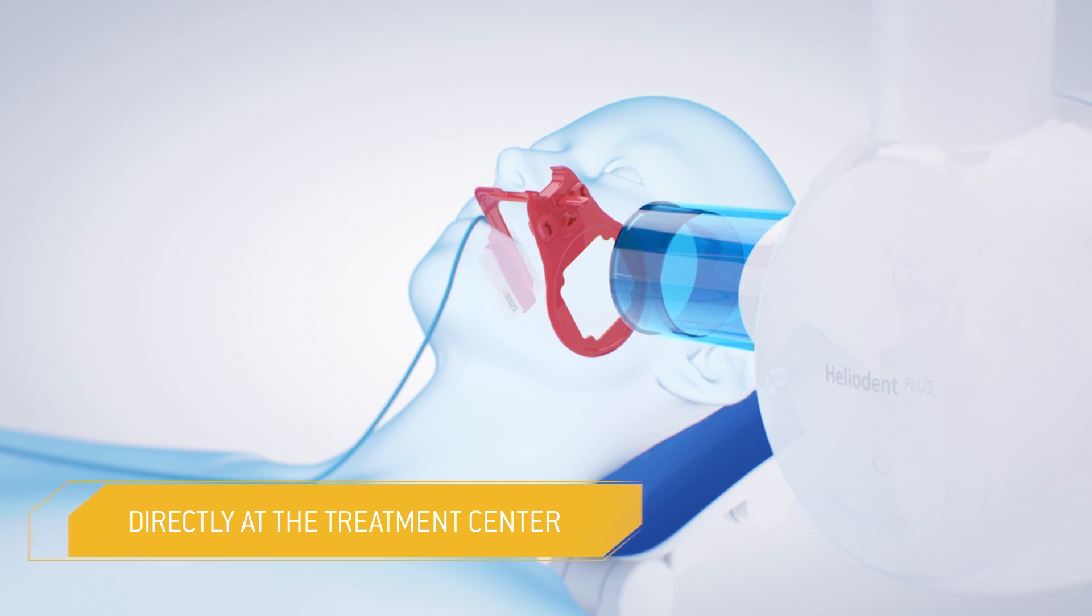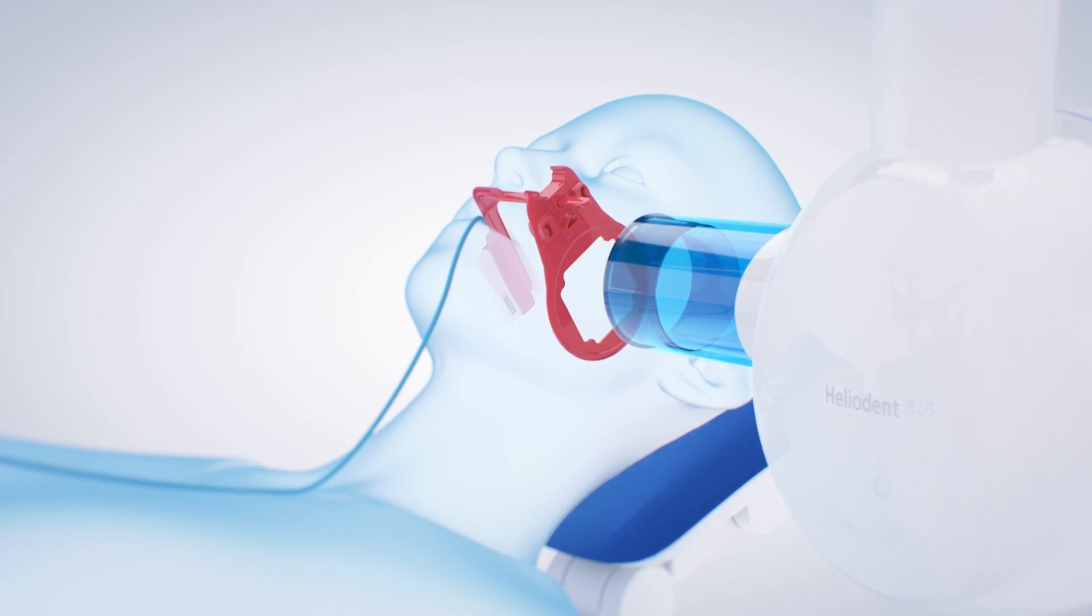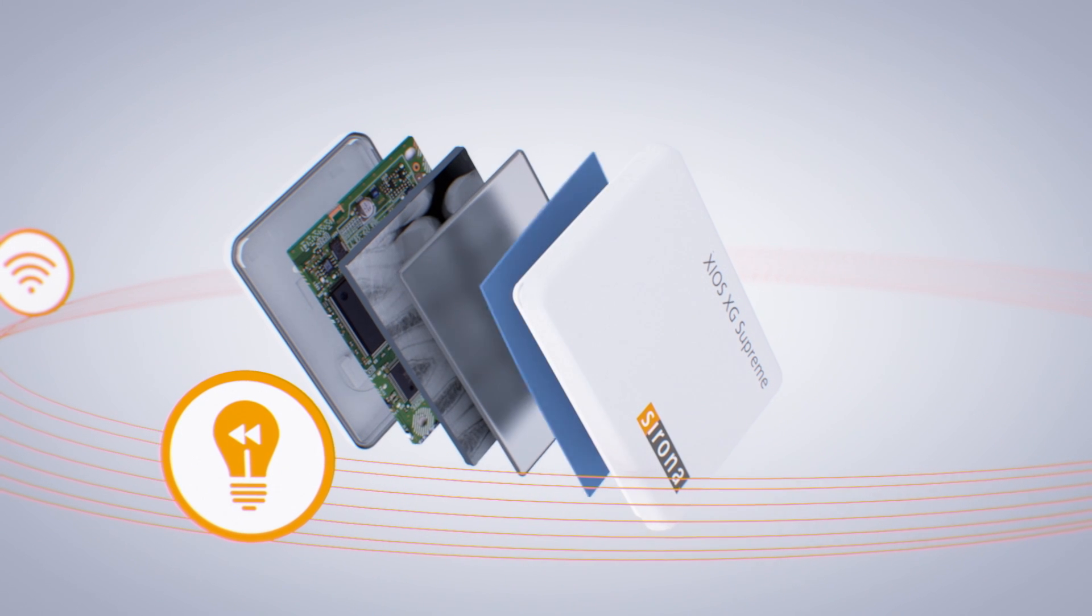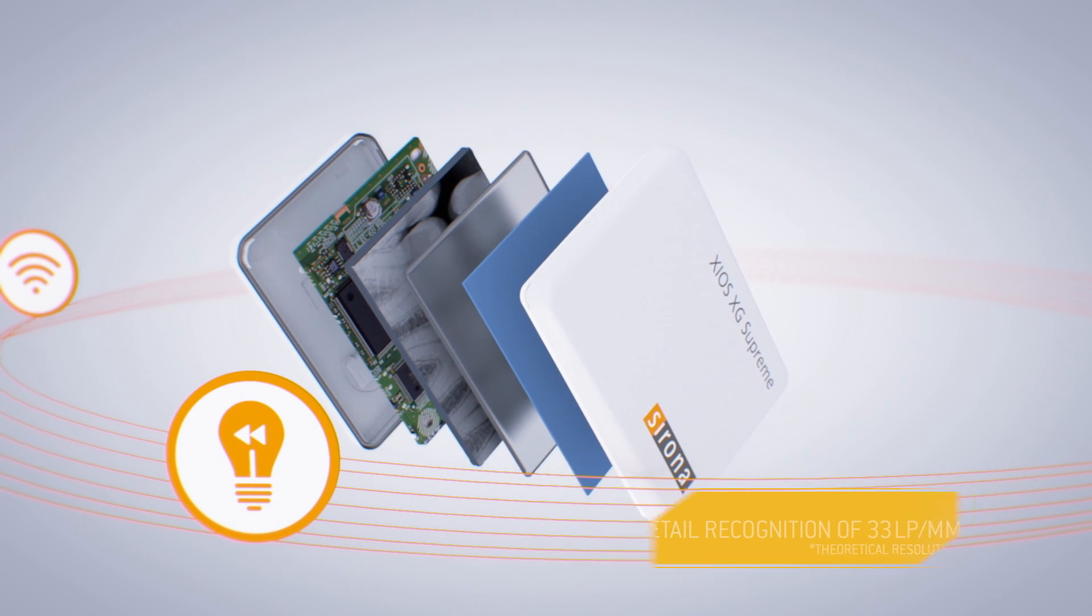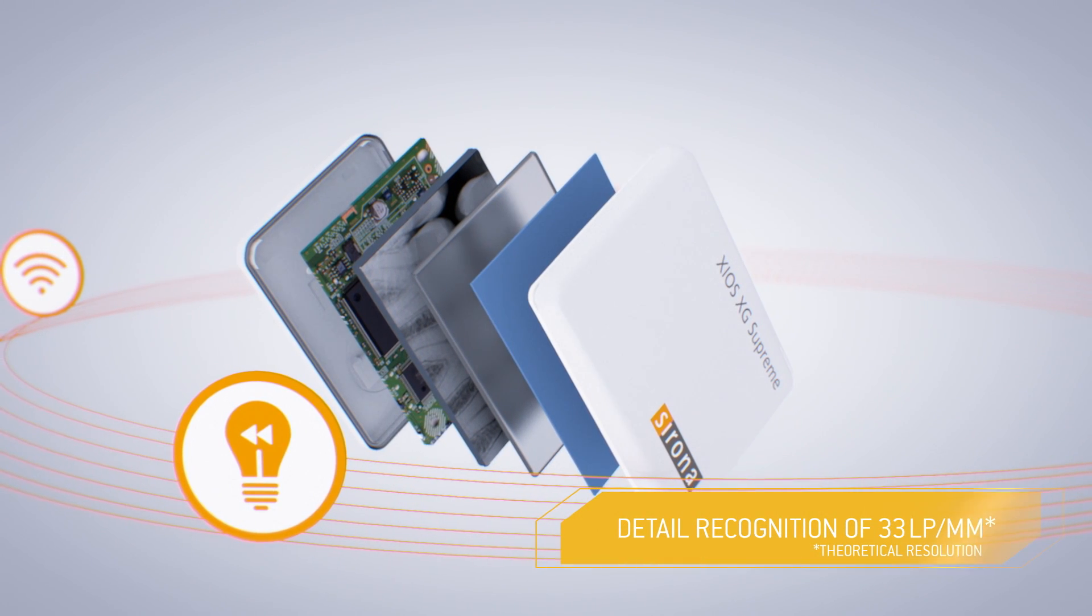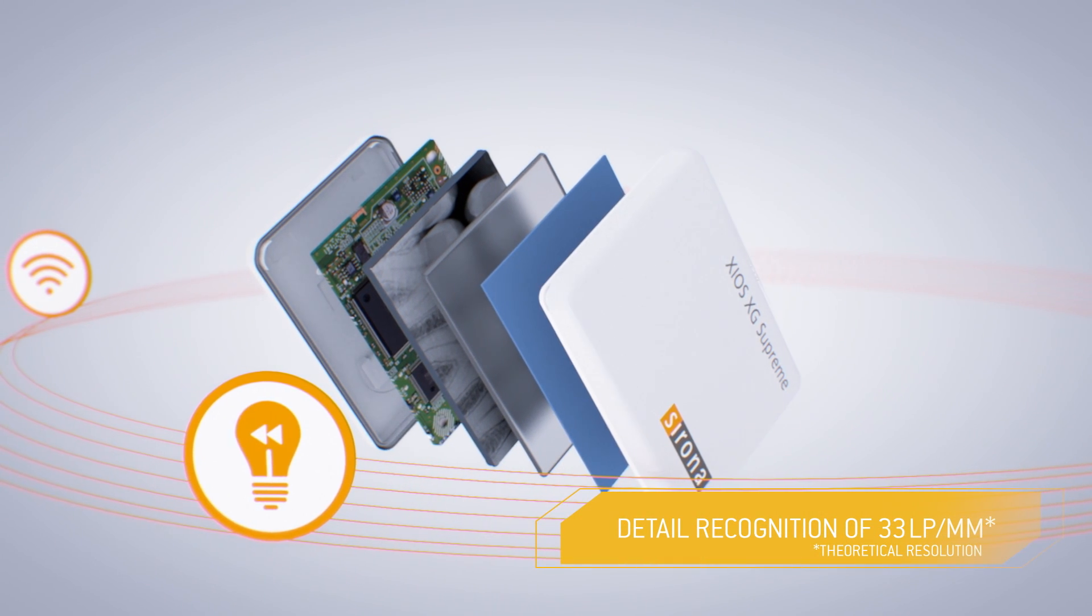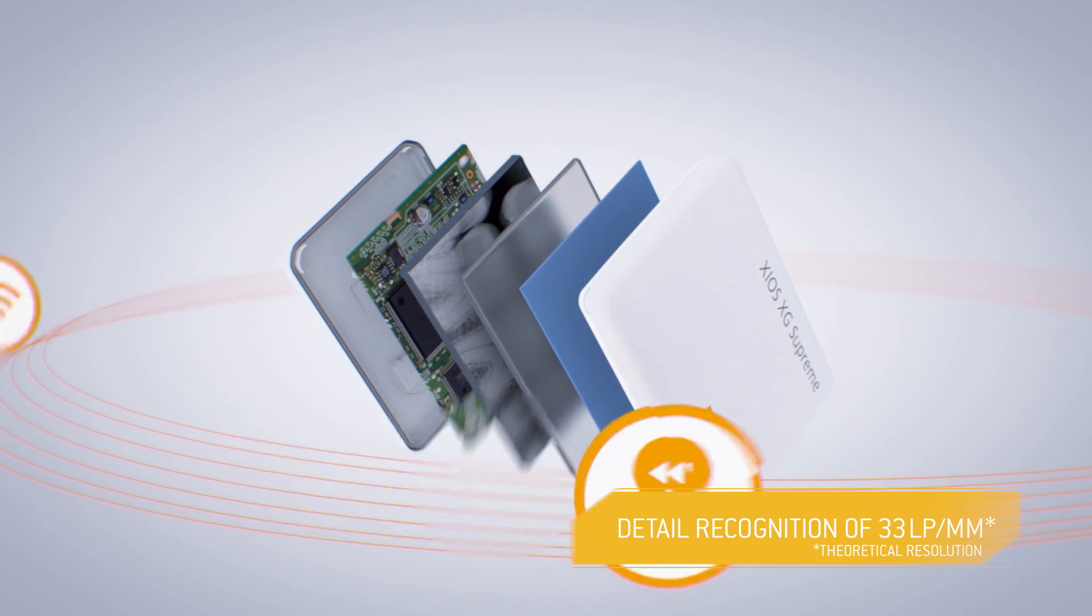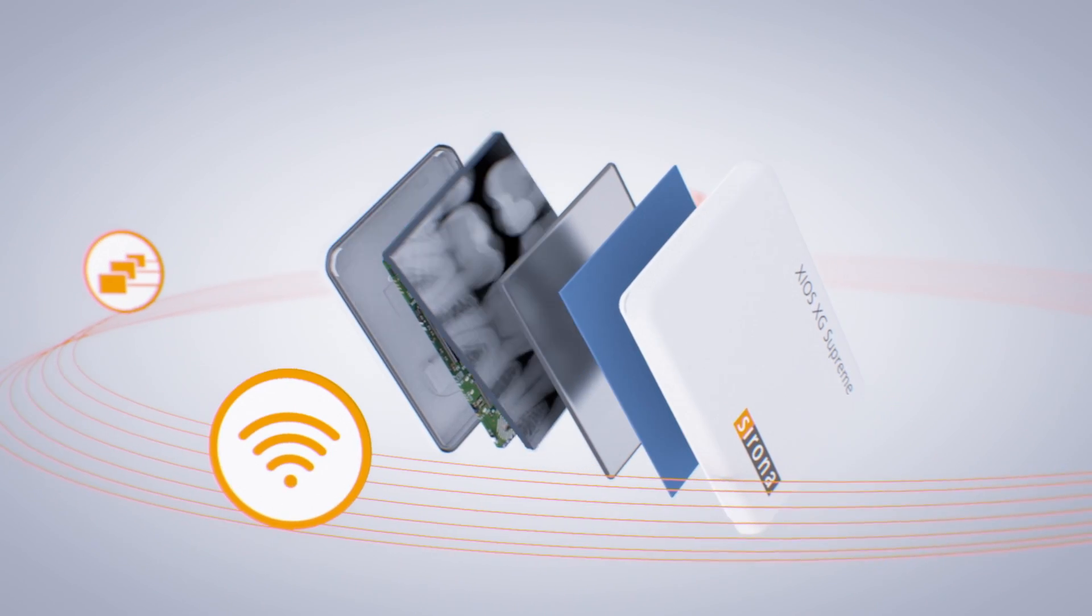In the process, second-generation CMOS APS technology and a CSI scintillator team up to deliver low-noise, high-contrast images for superior diagnostic reliability.